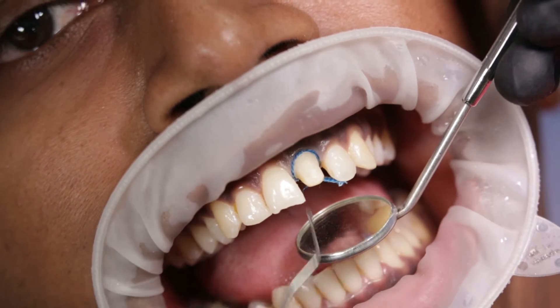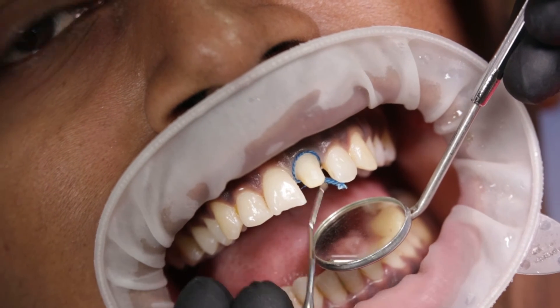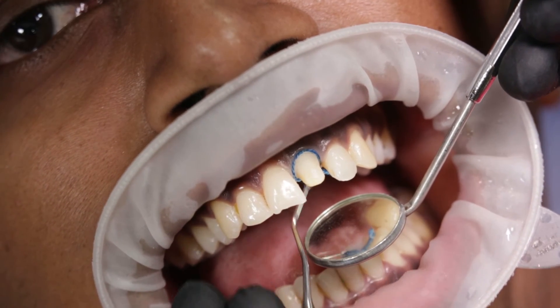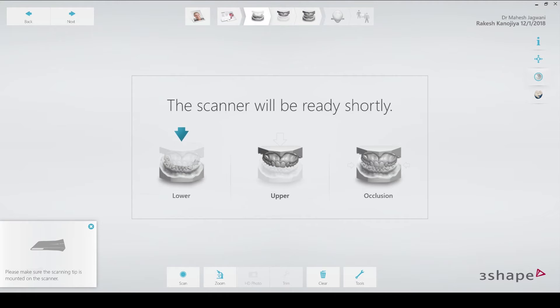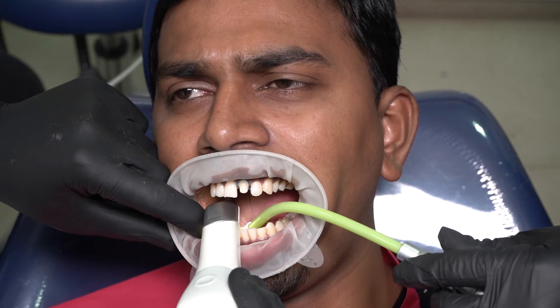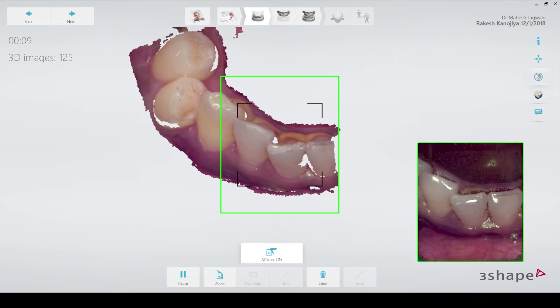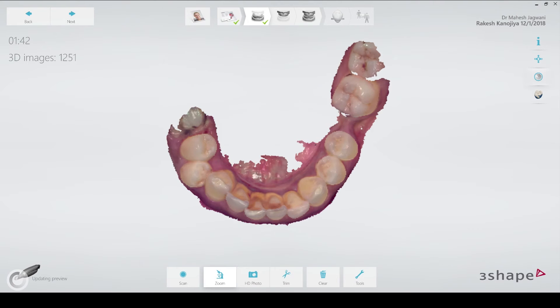My 3Shape Trios scanner is now ready while I pack the second cord, which is a number one cord, to give me some amount of horizontal retraction so I can scan the margin cleanly. I have already entered a manual shade before starting the process so I can send it as a reference to the lab. I start scanning with the usual workflow beginning with the lower arch — you can see how easy this system really is. It's a class apart, be it a matter of speed or just the simplicity of the workflow.